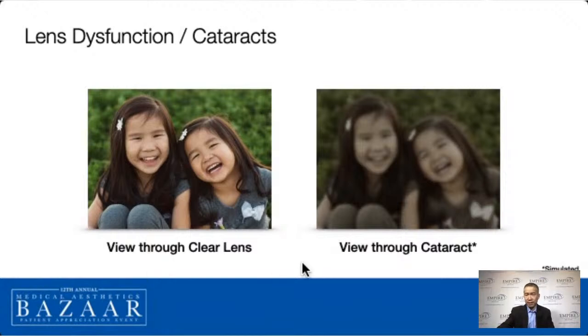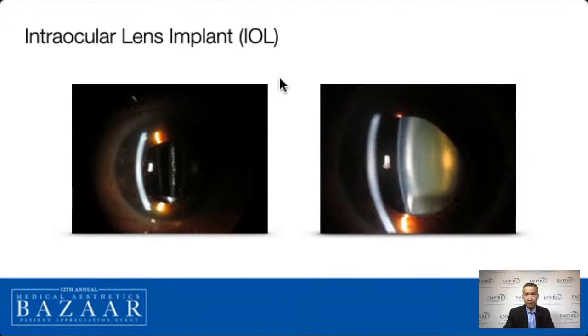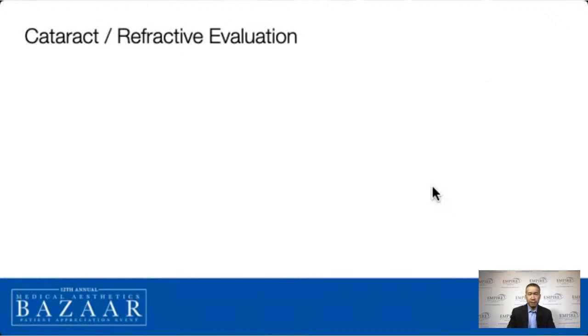We'll move on to the next slide here. This is an example of what it looks like after we have lens surgery. Schematically, that lens in there, instead of being hazy like it was before, is basically removed and the lens implant put in its place. The surgery itself is generally pretty quick and painless, and the vision recovers quite quickly. So that's what a cataract looks like, and a replacement lens looks like that. Compare the left side there, where it's nice and clear, and the hazy cataract on the right side.